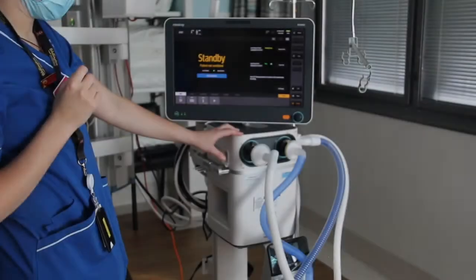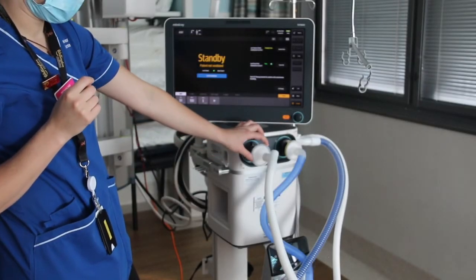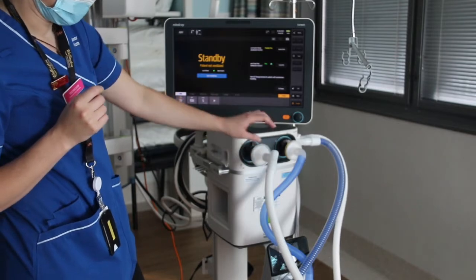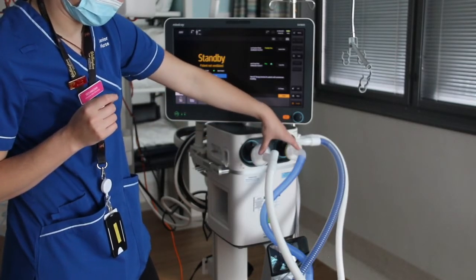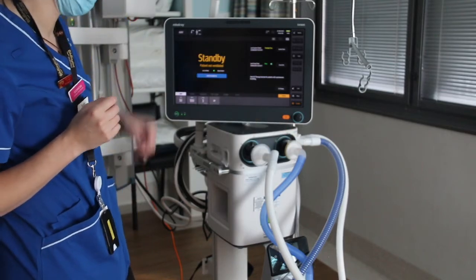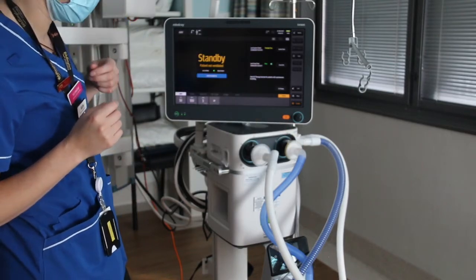Here in Wellington ICU, there's a viral filter that comes in every wet circuit packet. We add an additional viral filter of the same spec so that we've got both sides of the circuitry and we have the filter attached to them. We do that routinely with all of our patients.